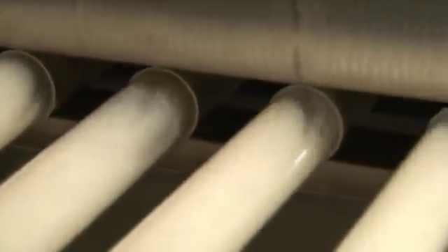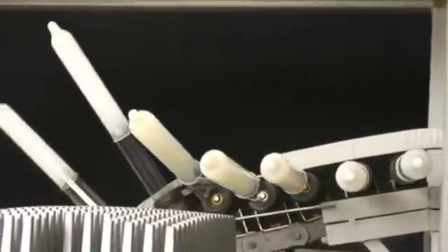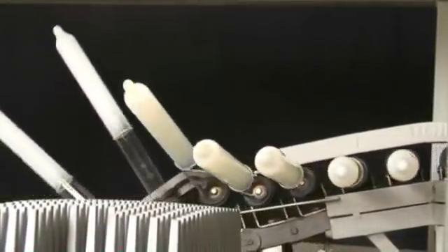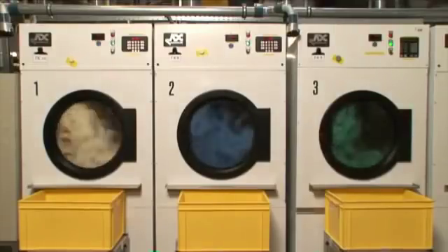Another important processing stage of condom production is the creation of the rolling rim. For this, every condom is given a rim at the open end of the former that can be rolled down. A final drying process called vulcanization makes sure the condom has the required elasticity. Now the dried condoms are stripped from the glass formers to be washed and dried. During this process, the condoms receive the required dry coating.